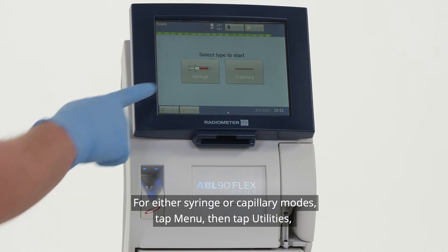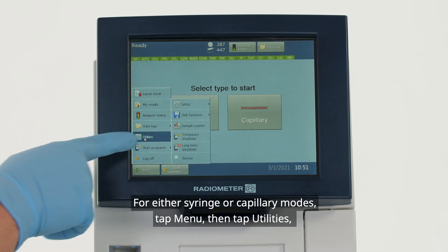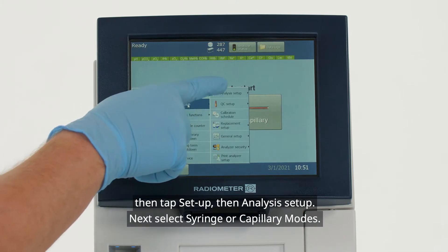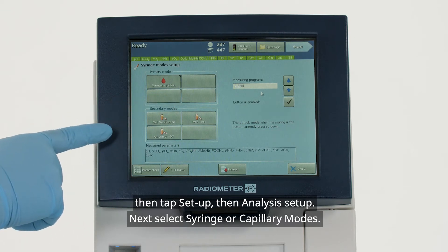For either syringe or capillary modes, tap Menu, then tap Utilities, then tap Setup, then Analysis Setup, and next select Syringe or Capillary Modes.